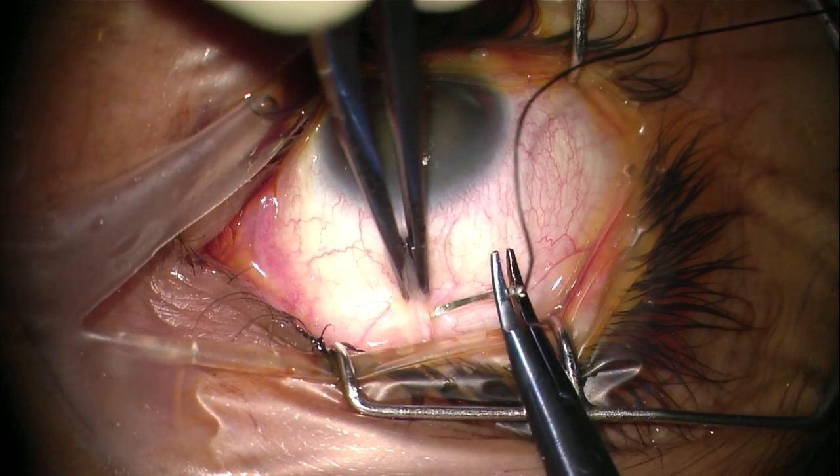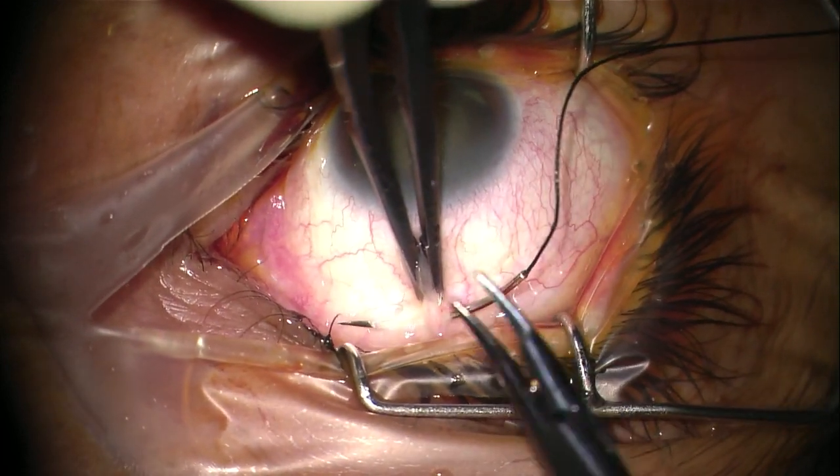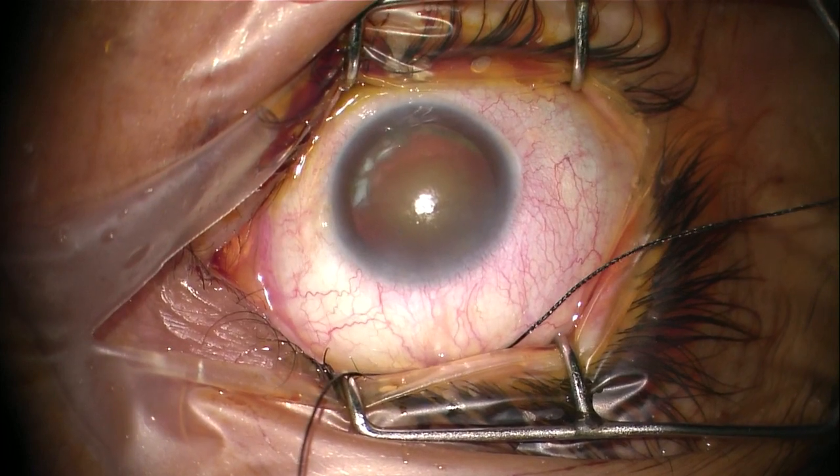We start with the 4-0 superior rectus fixation suture. This fixation suture helps to expose the superior field where we are going to create our scleral tunnel, and it also helps during taking out the nucleus later on.